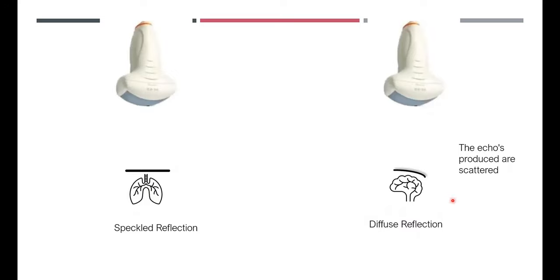But a good example is when you do cranial ultrasound. If you look at the surface of the brain, it's quite irregular, with a very bright sulcal gyral appearance. But if you go into the deeper structures of the brain, you have a lot of different echoes, which produce the individual intricacies of the anatomy. Dots, which reflect the corpus callosum, and which reflect the ventricular surface. Again, the ventricles being fluid, with uniform density, represent a relatively hypoechoic area.